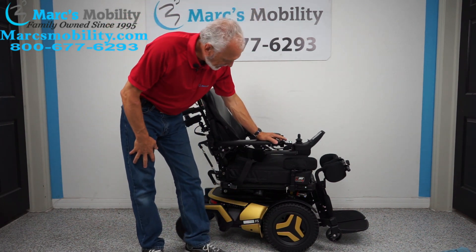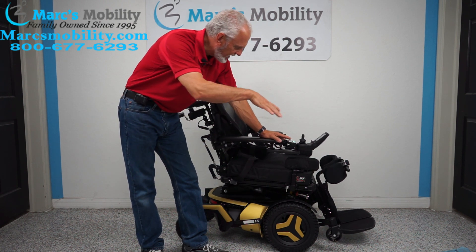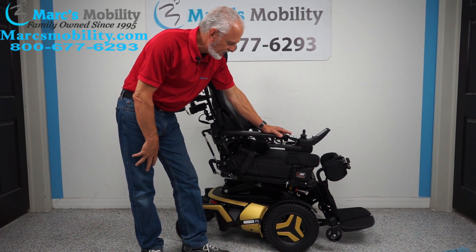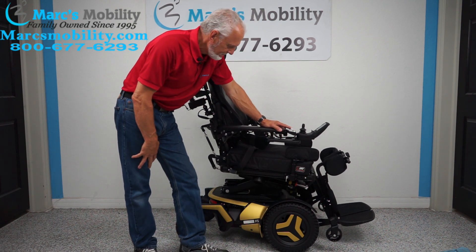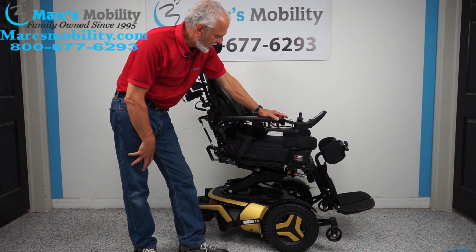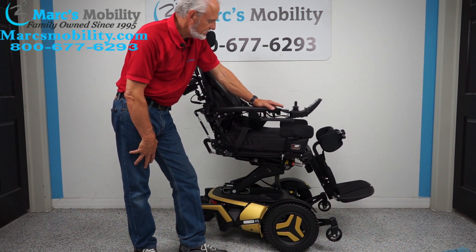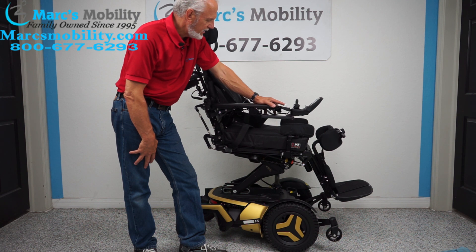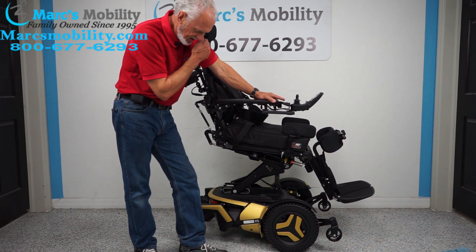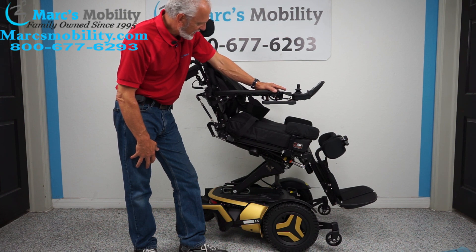Once you have the chest guard and the knee brace on, you can start going up. When you go up, you'll see the seat will do all kinds of little functions as it's working its way up. You'll see the foot plate went out, and the back is going to start coming down. And there goes the standing feature right now — this is the standing power chair.